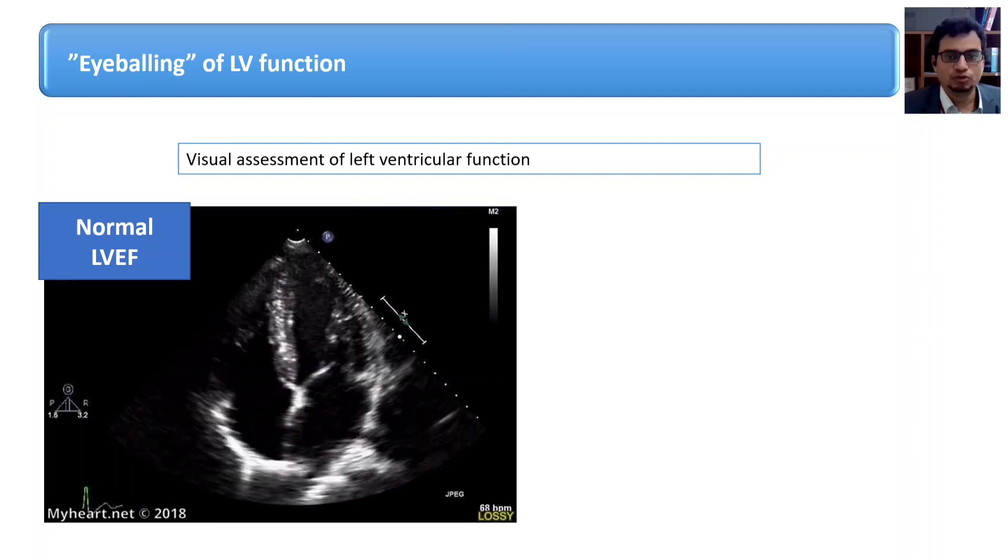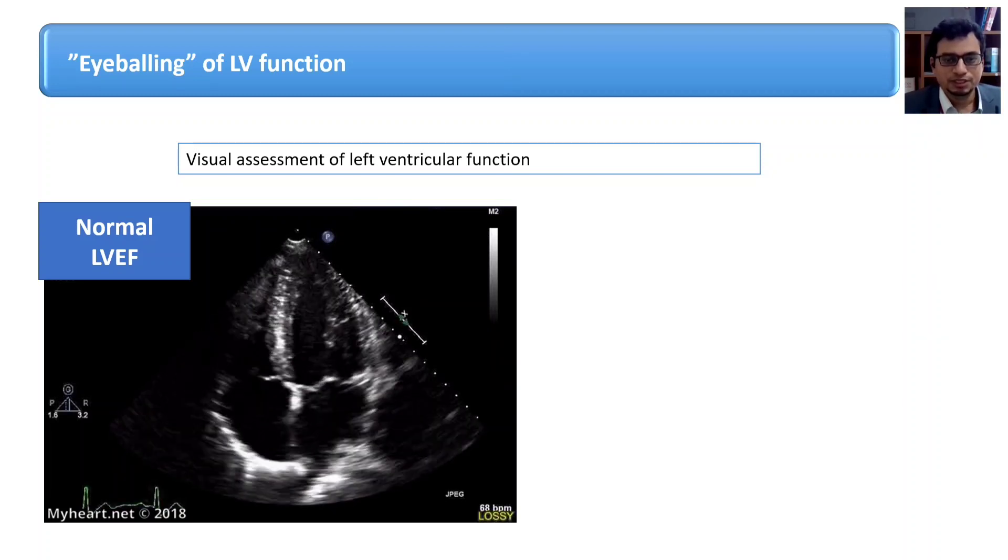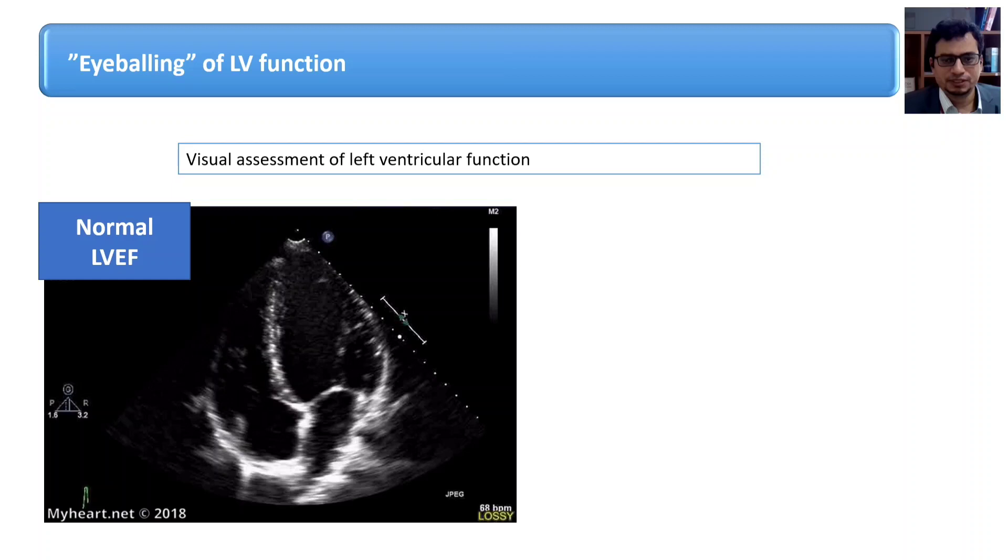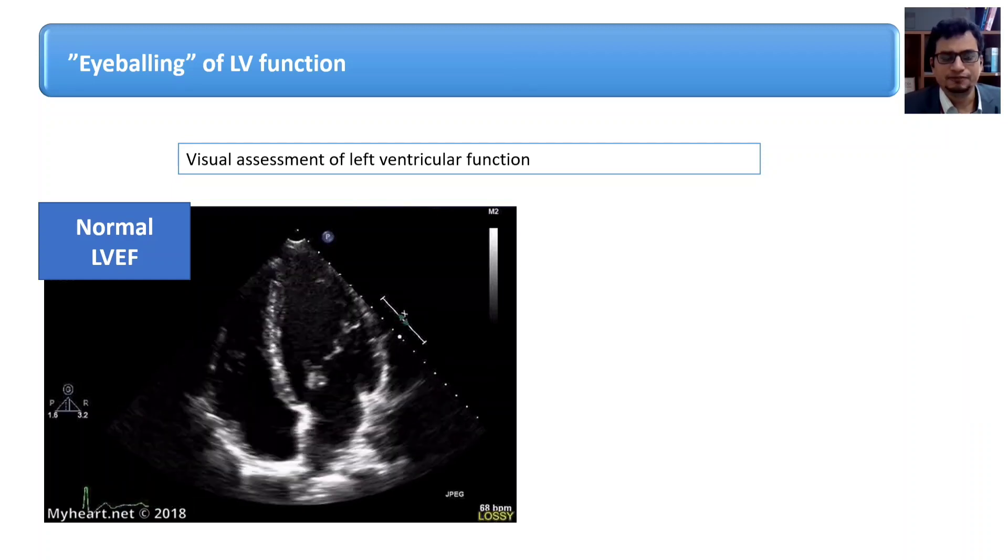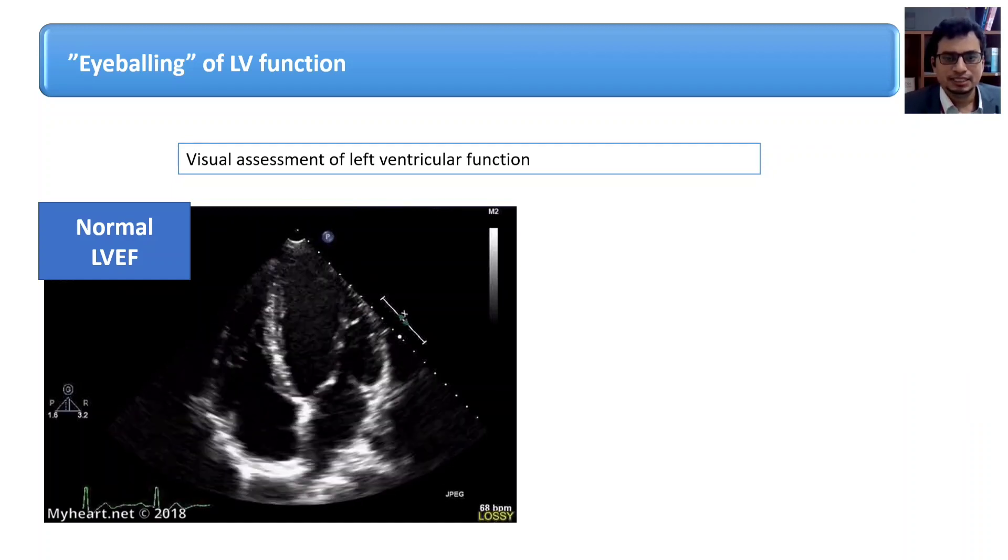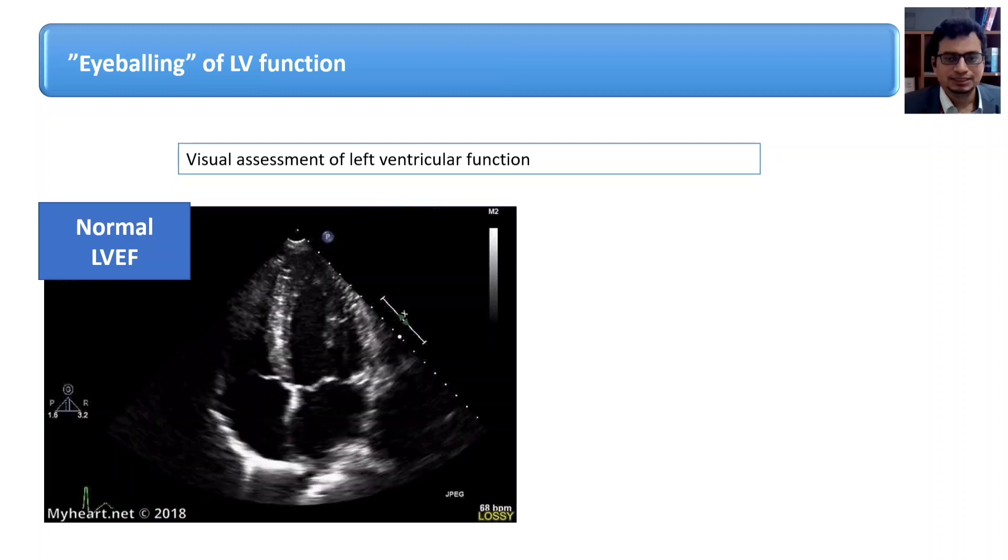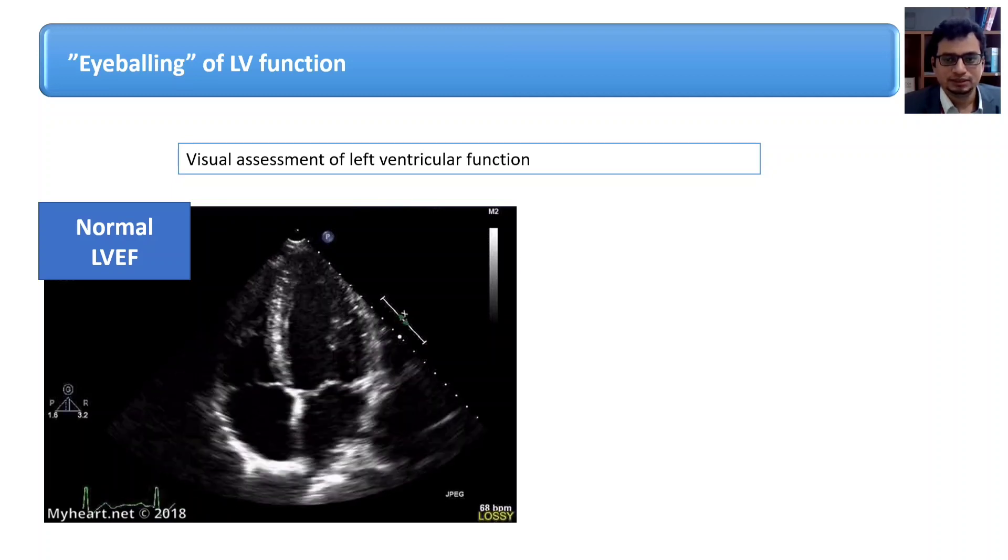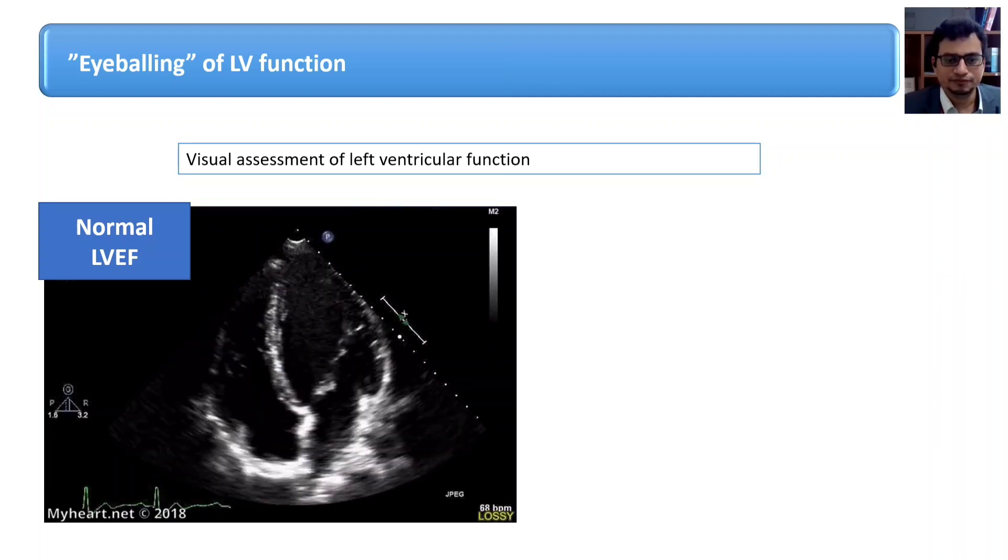Now the last method which we are going to learn is the eyeballing which is very commonly used by intensivists and a convenient method of estimating the left ventricular systolic function. It is based on the observation of the regional myocardial movement.